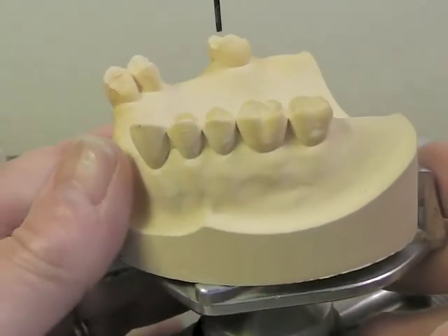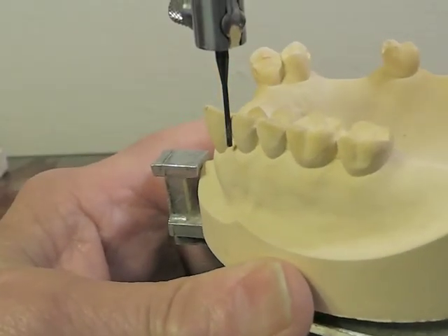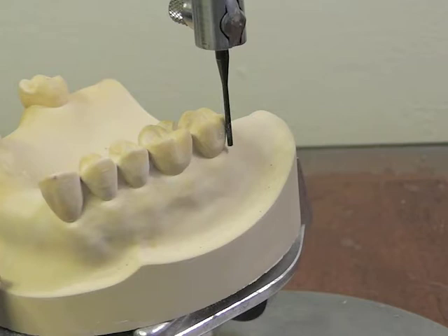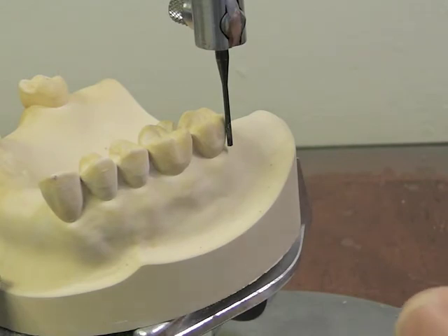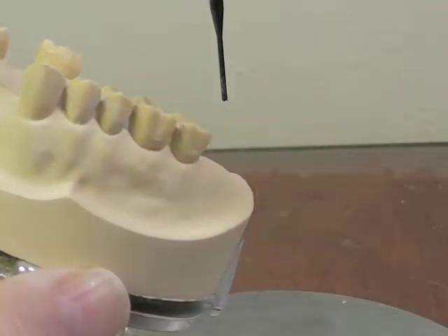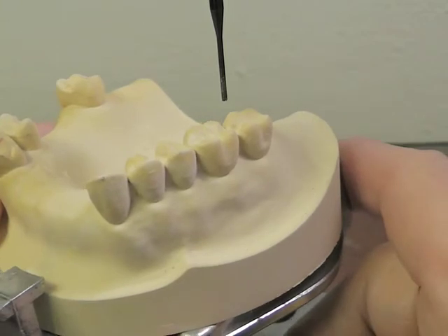On the other side, we're going to try and balance this out so that we have relative balance of our partial denture. We're going to look at the mesiofacial of our first premolar and the distal facial of our molar, and we have nice undercuts on both of those as it stands right now. We never want to move around too much because we'd just be creating false undercuts. When this partial is finally seated in the mouth, it's going to be relatively with the occlusal plane parallel to the floor, and you're just creating a false undercut in that area.